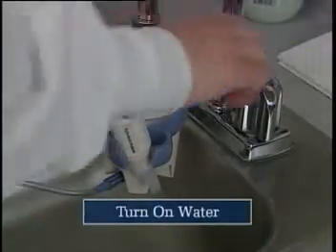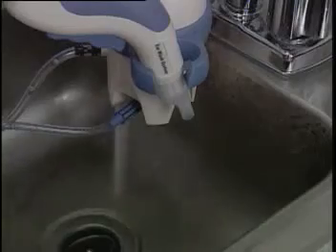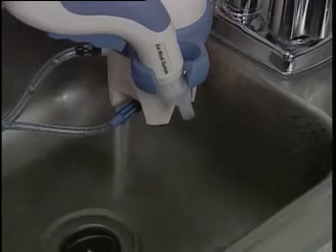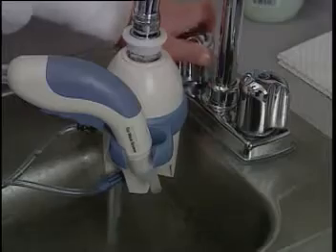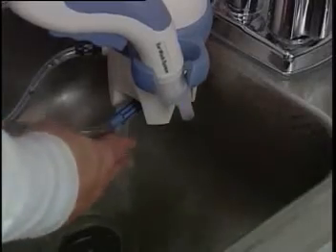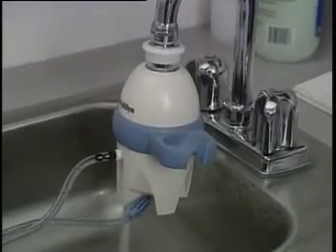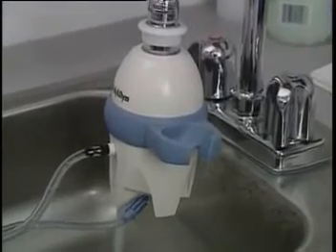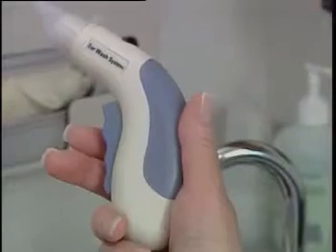Before you begin, run water through the unit by first turning on the cold water all the way. The faucet needs to be turned to its highest level so there's sufficient water pressure. Then gradually turn on the hot water until the water coming out of the bottom of the chamber feels close to body temperature. The pressure chamber will automatically regulate water pressure variations and will compensate for any sudden surge or drop in pressure from the faucet.